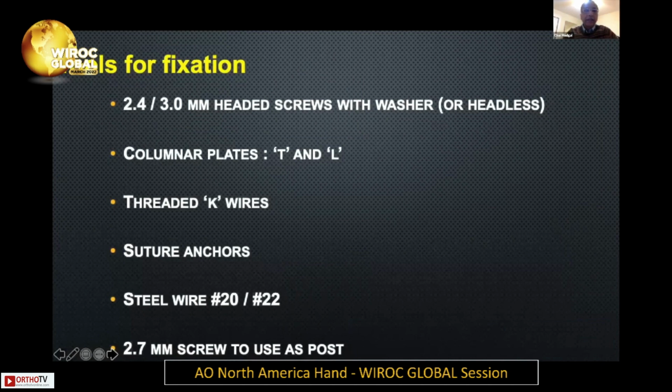I won't belabor the point by reading this, but I'm going to leave this for about 5 to 7 seconds. These are the tools I keep handy in my operating room whenever I'm dealing with a fracture of the distal radius where I'm concerned that a lunate facet fragment may be present.